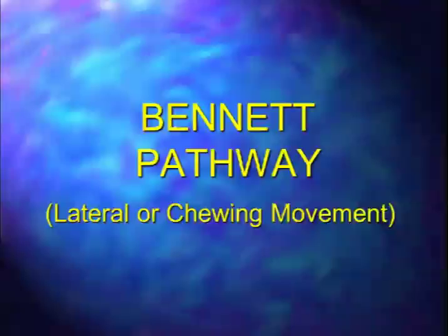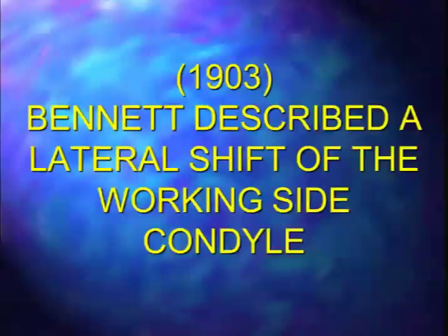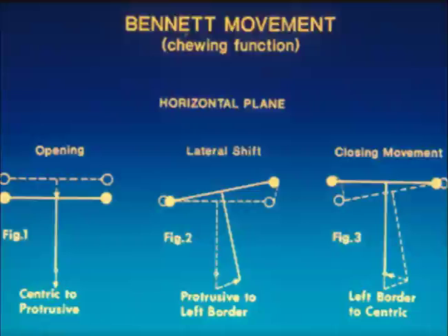The Bennet pathway deals with lateral or chewing movement. Bennet described a lateral shift of the working side condyle. As we look straight down on top of someone's head at opening movement, the mandible translates forward. Then we move laterally to a chewing side, and the working side condyle moves upward, outward, and backward as the non-working side shifts in. Now we're coming from a lateral position back into full occlusion.